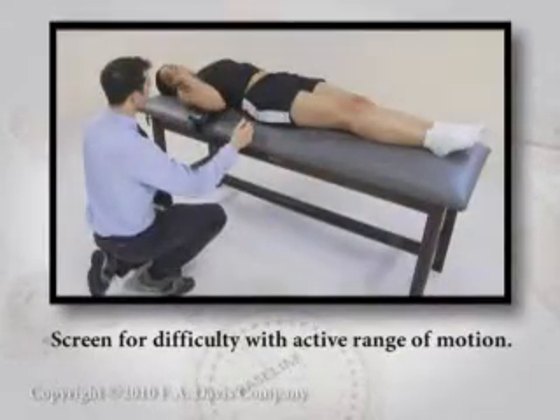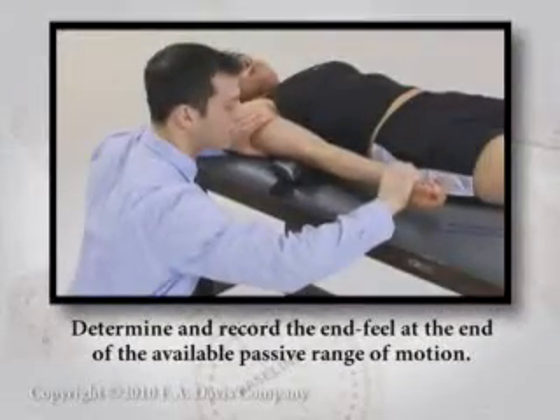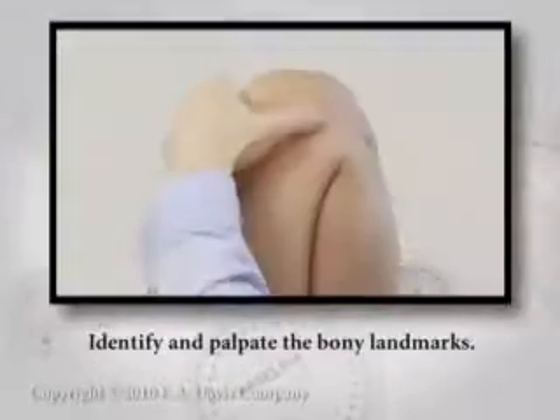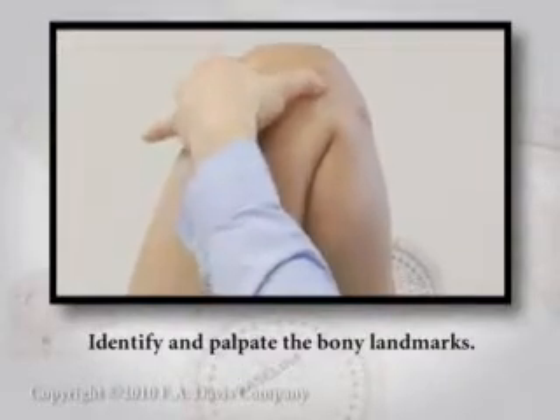Screen for difficulty with active range of motion. Determine and record the end feel at the end of the available passive range of motion. Identify and palpate the bony landmarks.